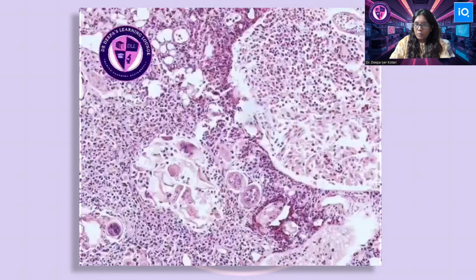You can have a foreign body granulomatous reaction also. Sometimes the granuloma is predominant, especially in chronic cases. You may not have much eosinophilia, but the granulomas can give a chronic granulomatous disease kind of picture. They are composed, as you know, of epithelioid histiocytes, numerous eosinophils, foreign body type giant cells, lymphocytes, plasma cells, and there can be surrounding fibroblasts if it is very long standing.